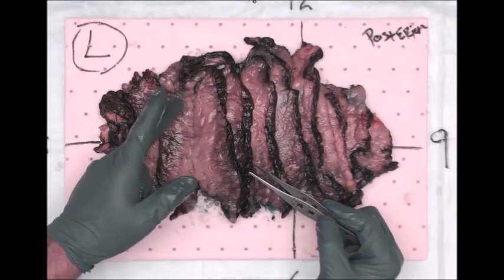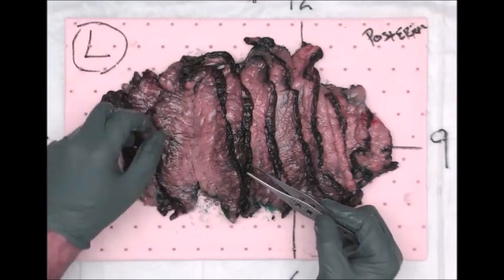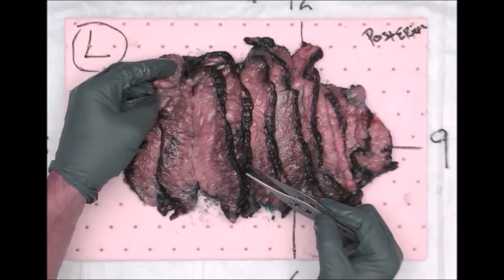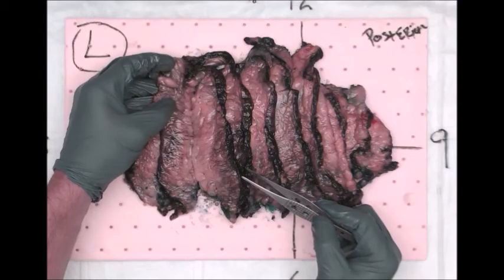Okay? And as far as this nodule goes, I'm going to talk about it being up in this quadrant and talk about its relationship to the margins and what the closest margin to this nodule is.